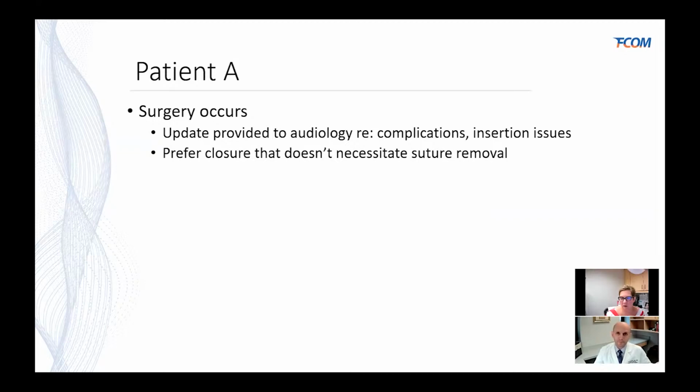Yeah, and the audiologist at that time, we don't typically always schedule the patient to come back and see the physician at the activation. But I think Dr. Gantz can echo this. He relies on us to assess that surgery site, to look and make sure there is no redness and no breaking down of the skin before we do that activation. We're typically doing activations about 2 weeks post-surgery, and making sure that site looks healthy before we do that activation is really important.